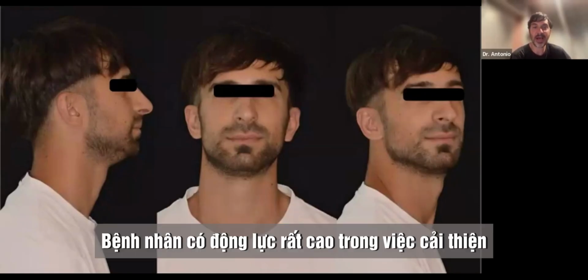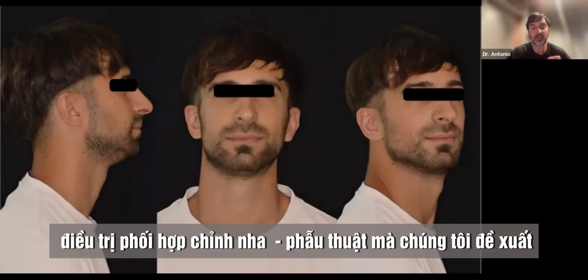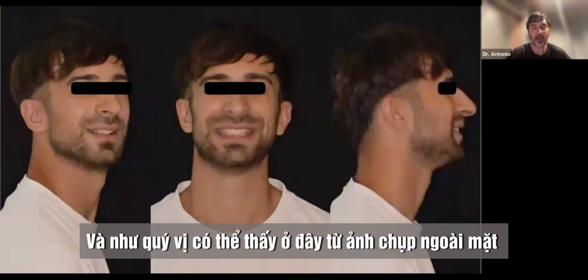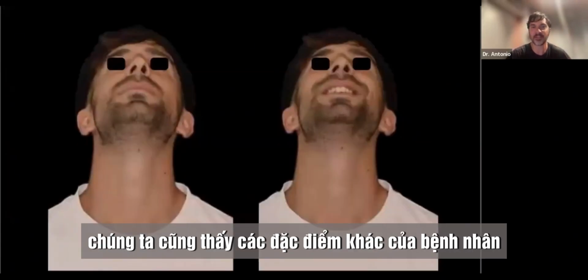The patient was highly motivated to improve facial aesthetics and therefore accepted our proposed combined orthodontic-surgical treatment. As you can see here from the extraoral pictures with lips closed and smiling, there is a second-class skeletal structure, but we can also see other characteristics of the patient.